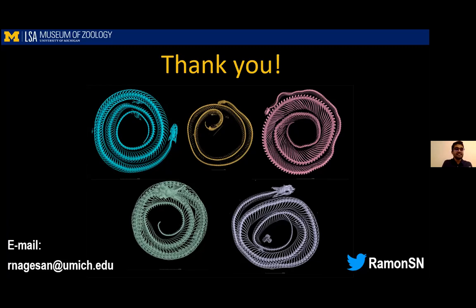Okay, so I guess I didn't explain that really well. For specimens that are wet preserved, the question is, how do you scan a specimen in a bottle of liquid? Do you have to take it out and dry it out? So we will take the specimen out of the alcohol, but we won't dry it out because that will have negative effects on the specimen. Generally, what I will do is pack the specimen into plastics and kind of like a heat sealed bag. And then we'll pack that into a plastic size appropriate container and then put foam around the specimen or packing peanuts to stabilize it. And then once the scan is done, the specimen can go back into alcohol.